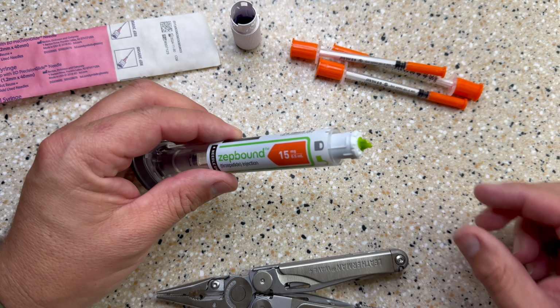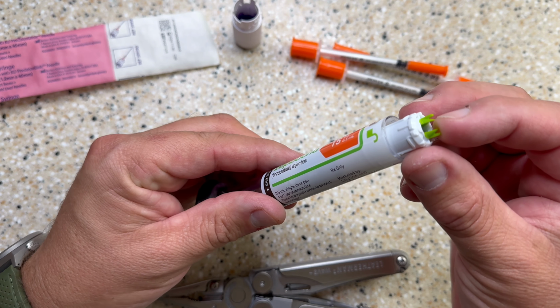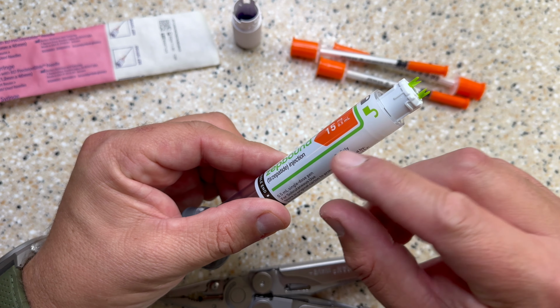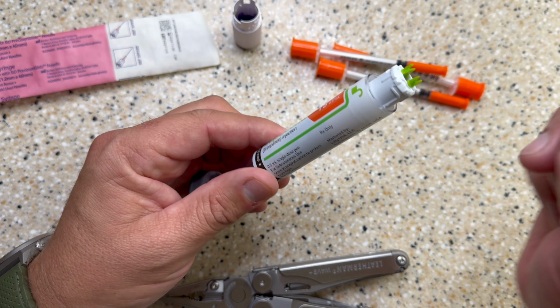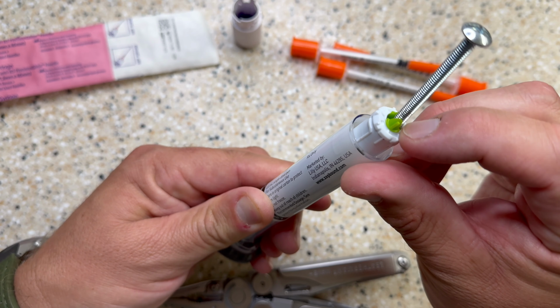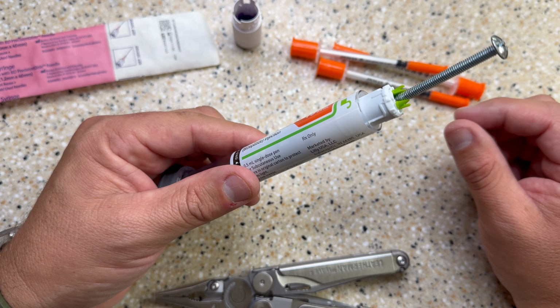So you'll see here, there are two green tabs. They're locked back here. This is the plunger and it's held up by a spring. So if you depress these, it's going to fire that injector. Insert a screw, just enough to keep from releasing and ruining your $500 to $1,000 product.